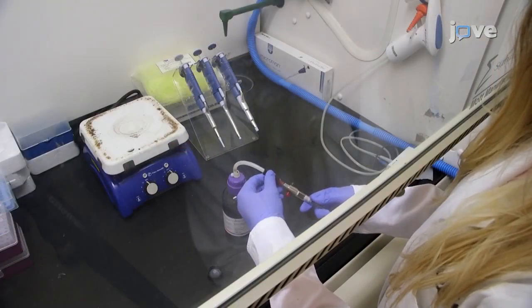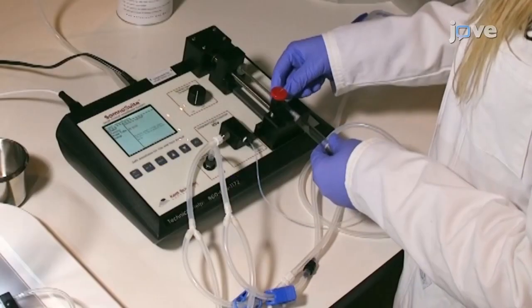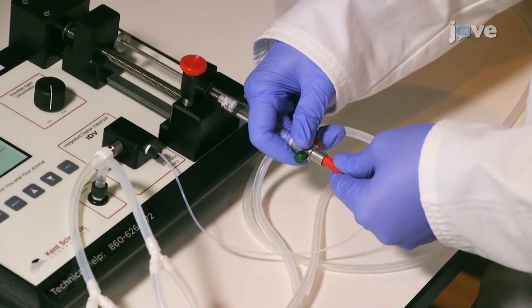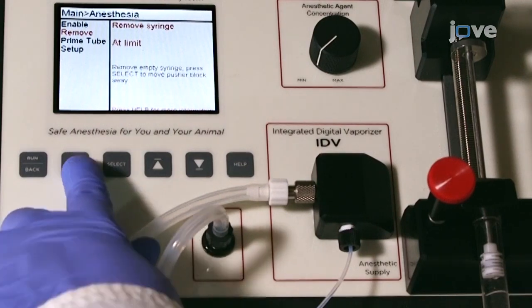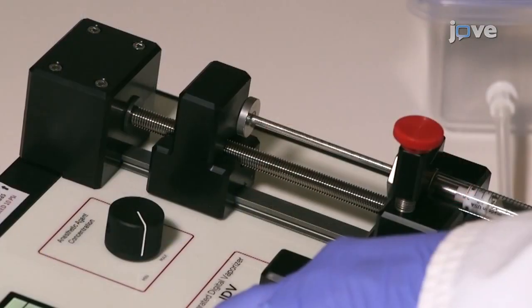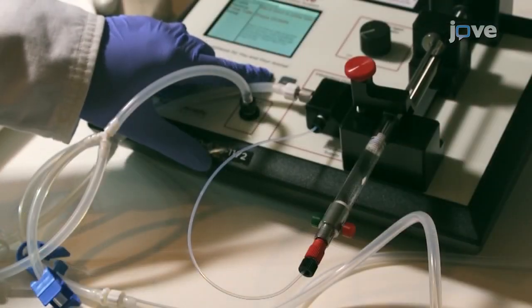and then fill with isoflurane using the bottle top adapter. After filling, place the syringe back into the retention block and attach the delivery tube. Next, prime the anesthetic delivery tubing by pressing the directional buttons. The system will depress the syringe until the anesthetic travels into the vaporizer block. It is important not to overprime the syringe.